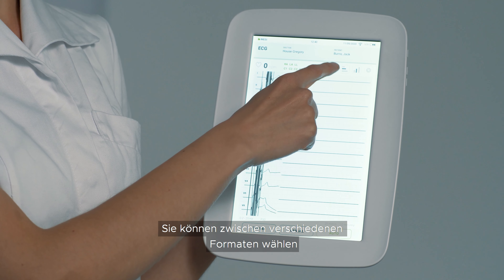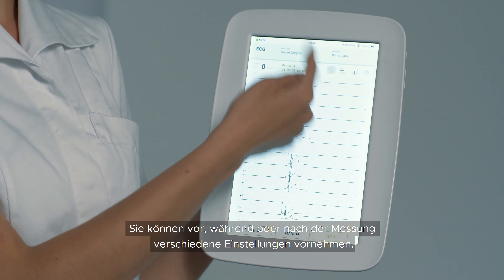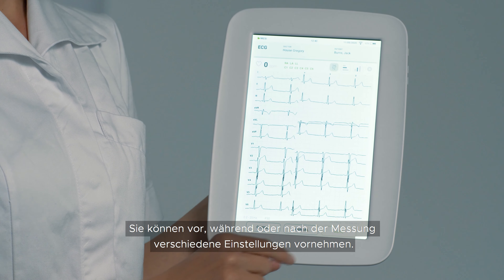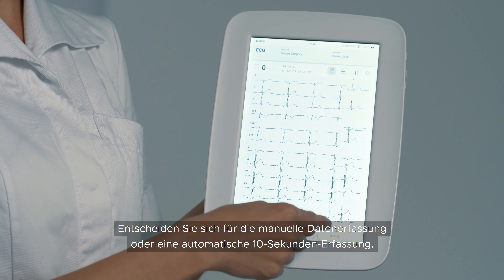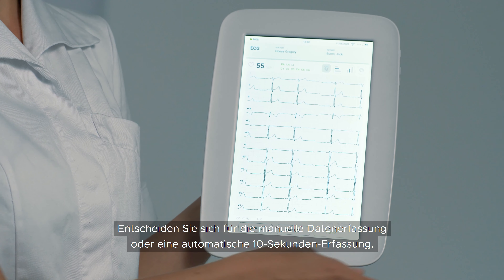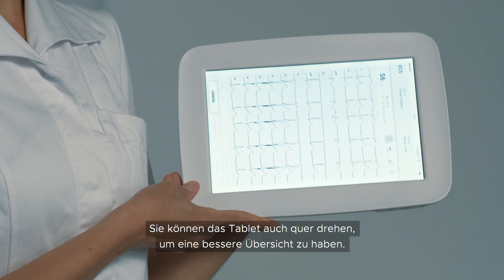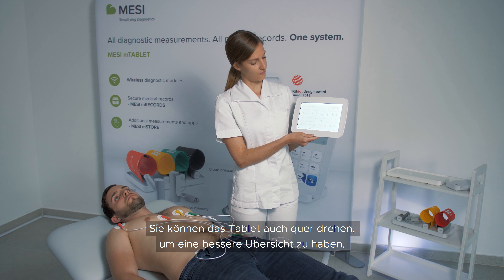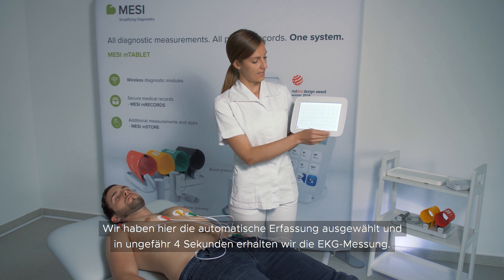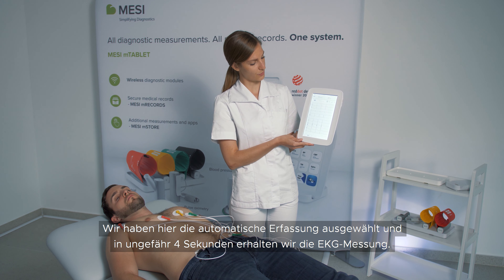You can choose different views and adjust different settings before, during, or after the measurement. You can opt for a manual capture or an auto 10-second capture. You can also always turn the tablet horizontally to receive a better view. We have chosen the automatic capture here, and in about 4 seconds we will receive the ECG measurement.